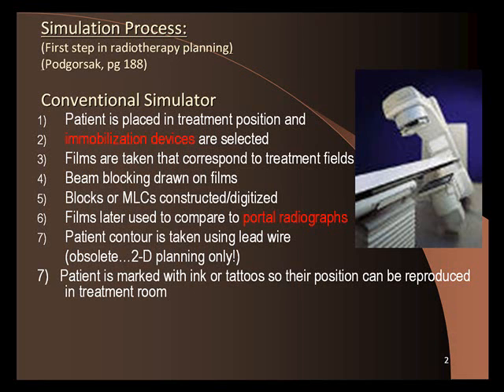Okay, and then when the doctor likes the angle, for example, if the doctor's treating prostate, they'll see the pelvis up here, ischial tuberosities down here, and the sacrum is down here. The doctor wants to treat the prostate, so the prostate's over here. So the doctor will place that gantry in the AP position, which is the 0 position, pointing straight down at the patient. And then they can center the crosshair on the prostate.